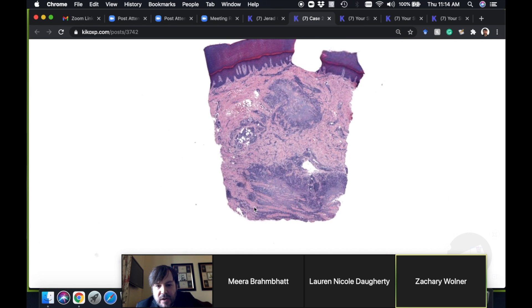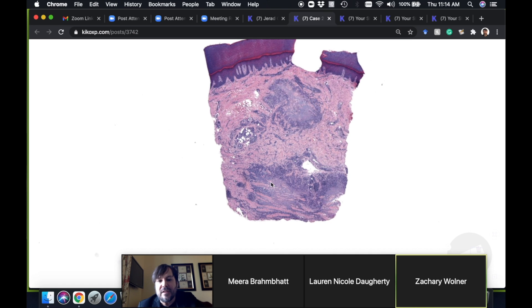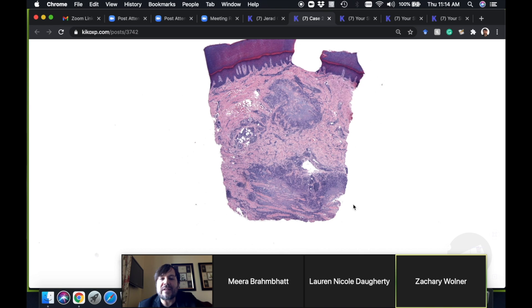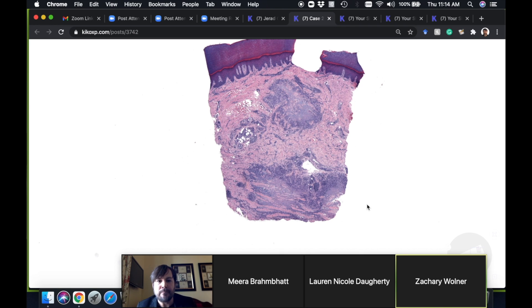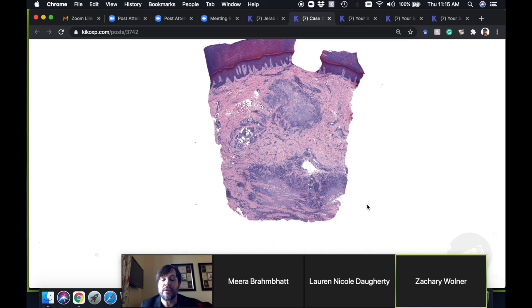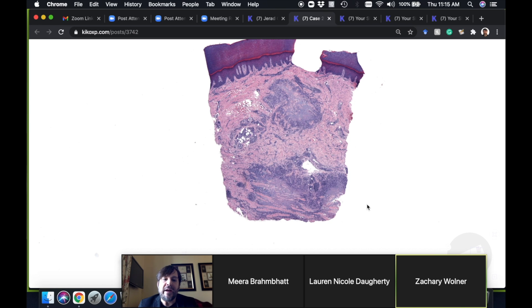You can see there's plenty of it here at the deep dermis pushing down into the subcutis. When there's a lot of subcutaneous involvement, we usually call that deep granuloma annulare. Those tend to present as one or multiple nodules often on the lower extremities of kids, sometimes on the hands or other sites too.